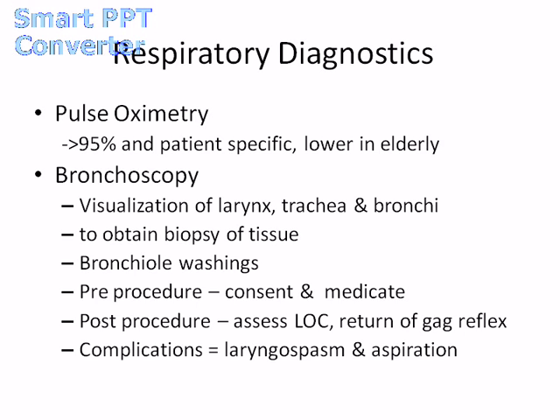Patients can be in a sitting position or in a semi-Fowler's to a high Fowler's, and we would have all our collection and labeling specimens containers for specimens ready. In the hospital, you're going to see respiratory therapists assist with this, and the nurse typically is there present to monitor the patient, to provide sedation, and to watch their vital signs. So we're going to be continually monitoring the respirations, blood pressure, pulse oximetry, heart rate, their level of consciousness.